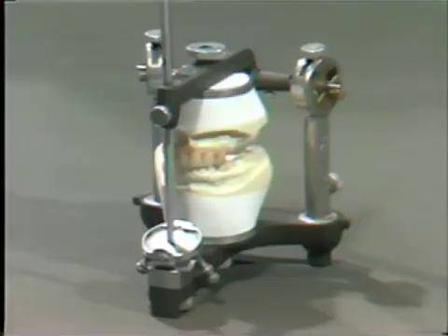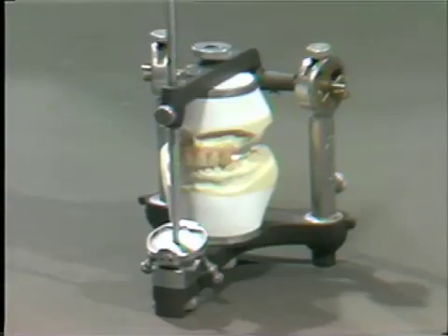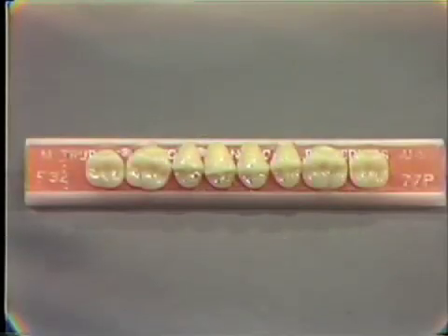After the anterior teeth have been set for the immediate denture, we can then proceed with the setting of the posterior teeth. The posterior teeth we are going to use for this exercise are a functional tooth, TrueBite Functional Tooth F32. This functional tooth is the same type of tooth that you may choose to use in the clinic.